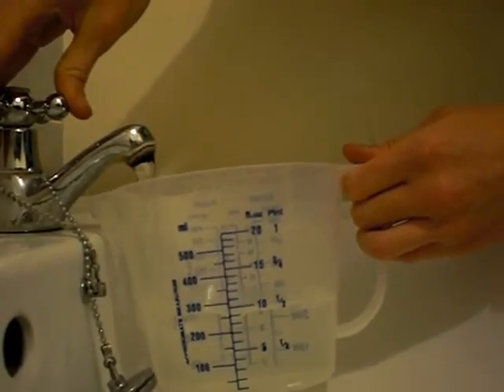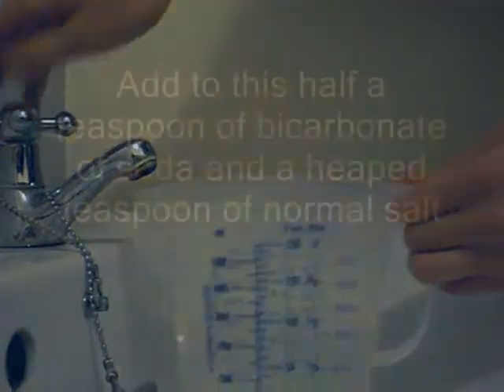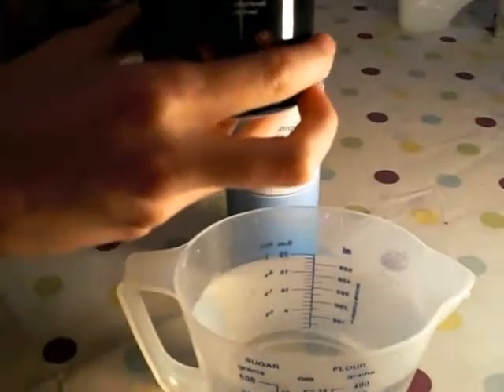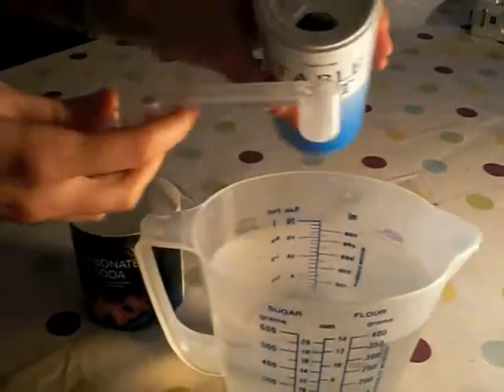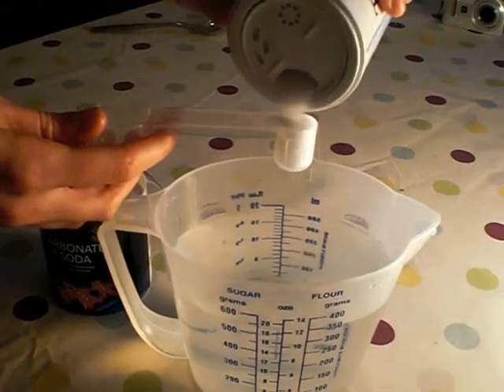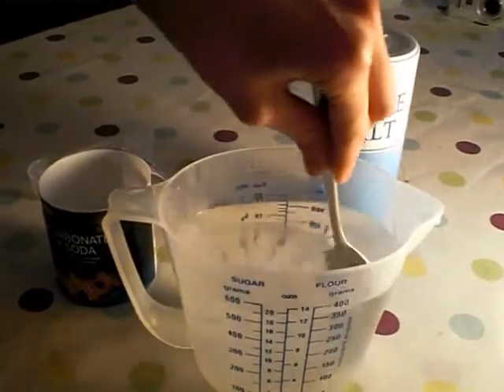First, fill your jug with one pint of tap water. Add to this half a teaspoon of bicarbonate of soda and a heaped teaspoon of normal salt. Stir until both the salt and the bicarbonate of soda are dissolved.